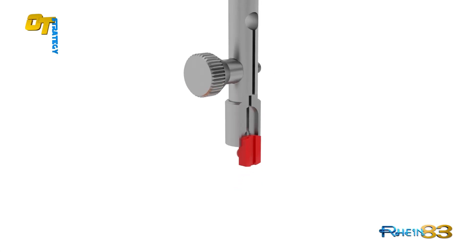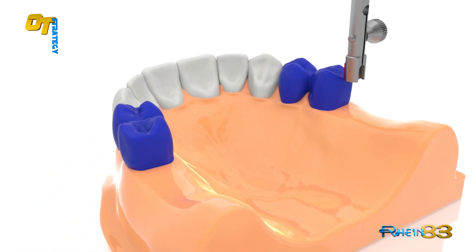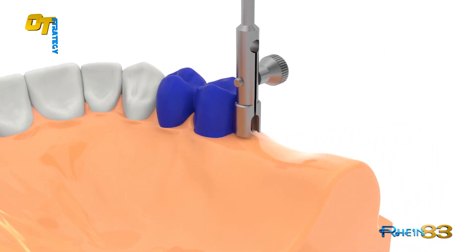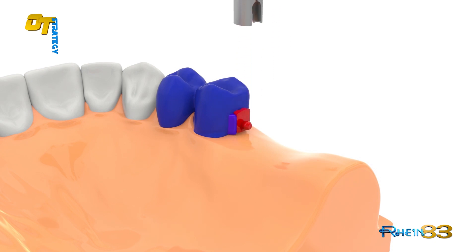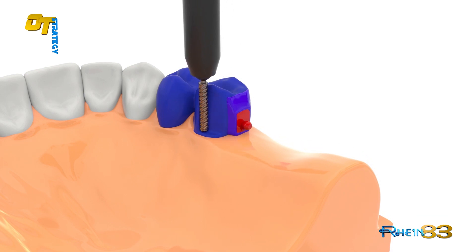Place the castable OT strategy sphere into the larger open side of the parallelometer key. Connect the castable OT strategy sphere to the wax crown, mill the lingual side of the wax crown, fill the empty spaces with wax and cast.